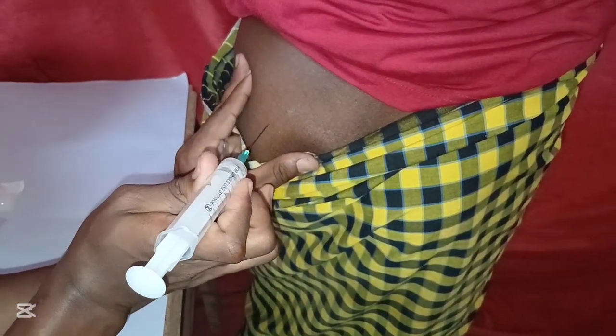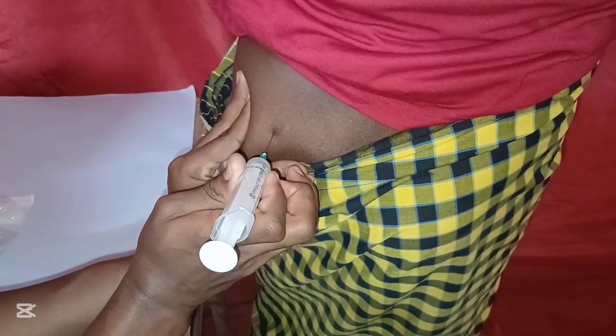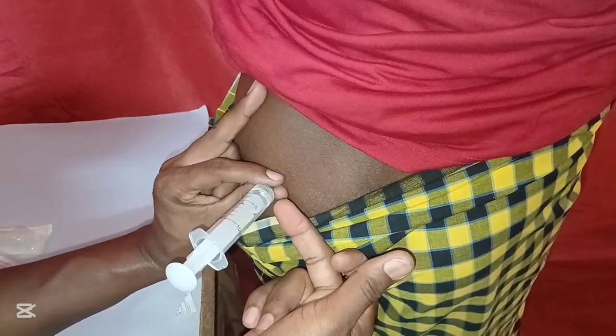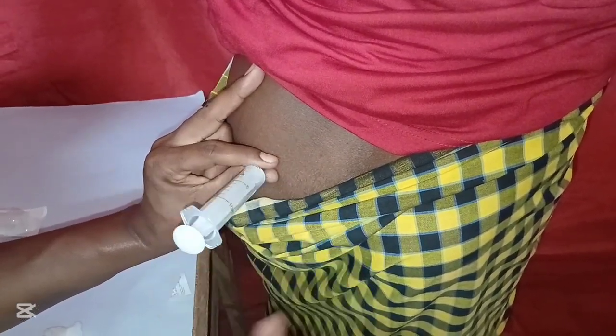You grab the skin first, you insert at a 90-degree angle deep into the muscle, then you release the skin. You grab the cap of the needle, pull back the plunger — if there's no flashback, that is a drop of blood, you administer the drug safely to the patient. When you finish, you apply a cotton wool.